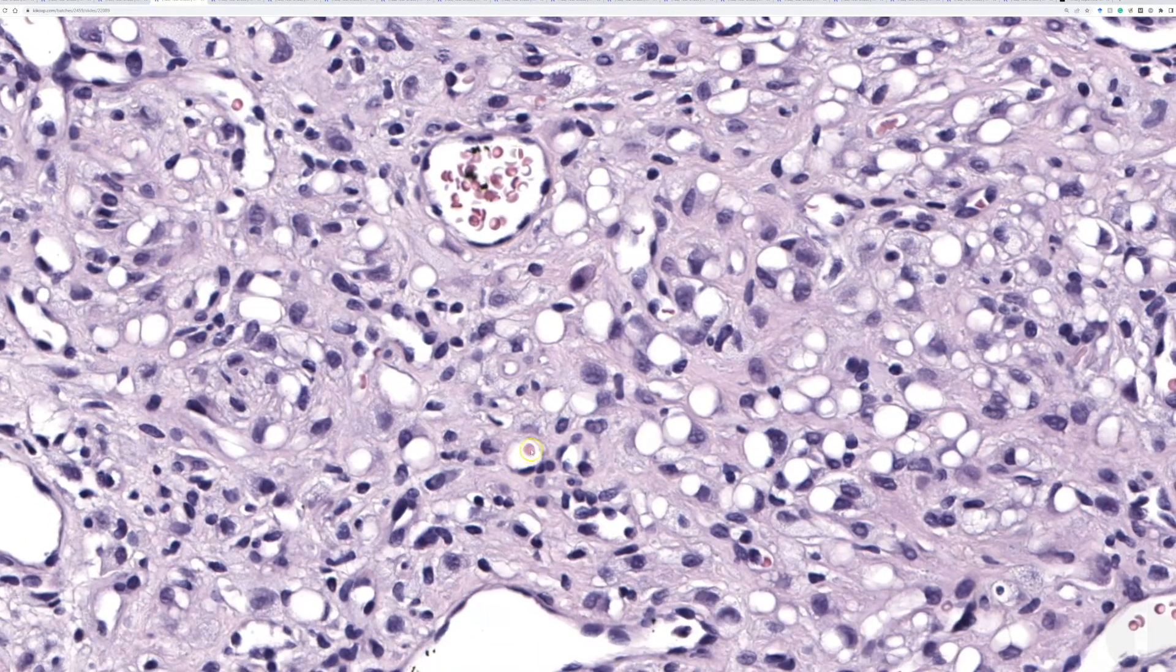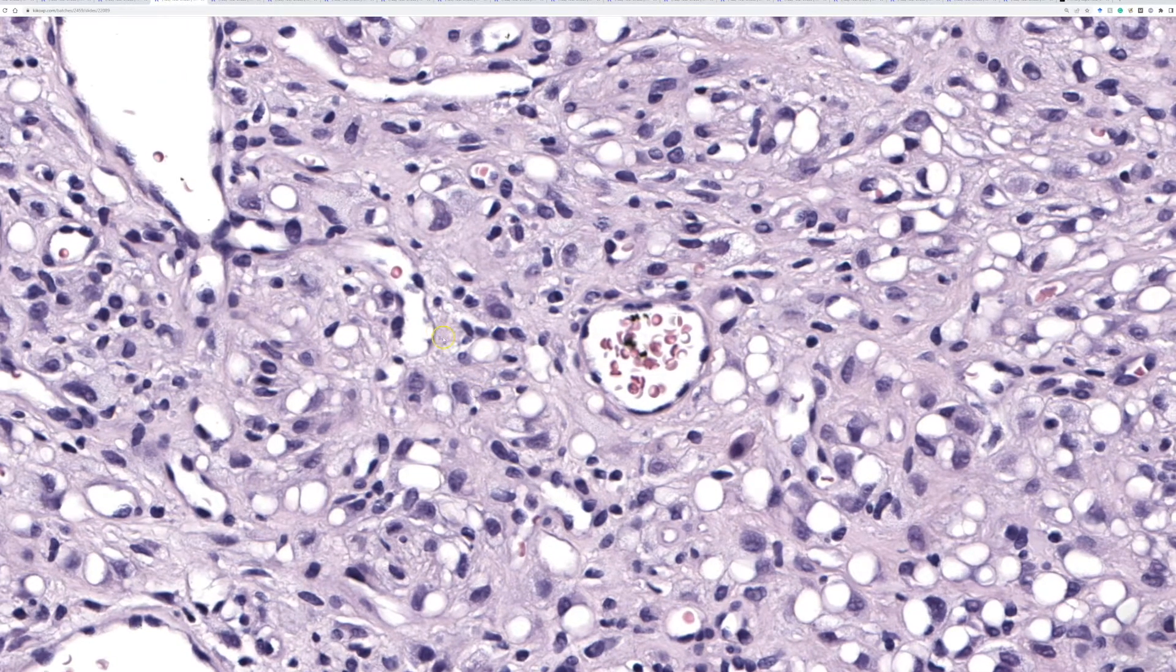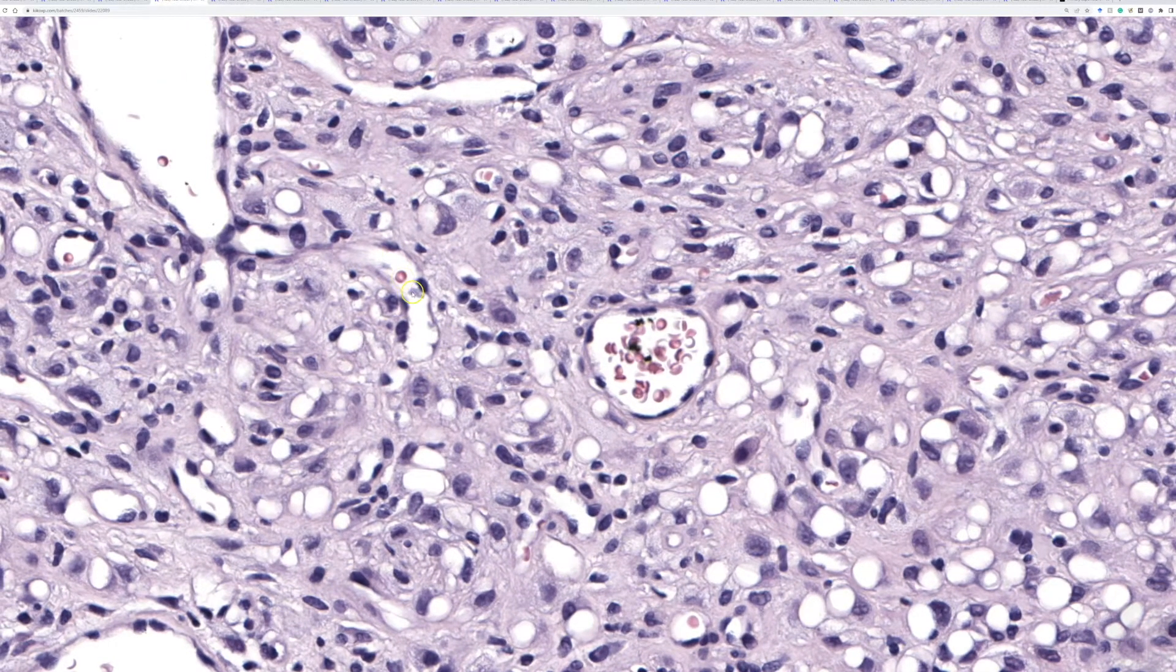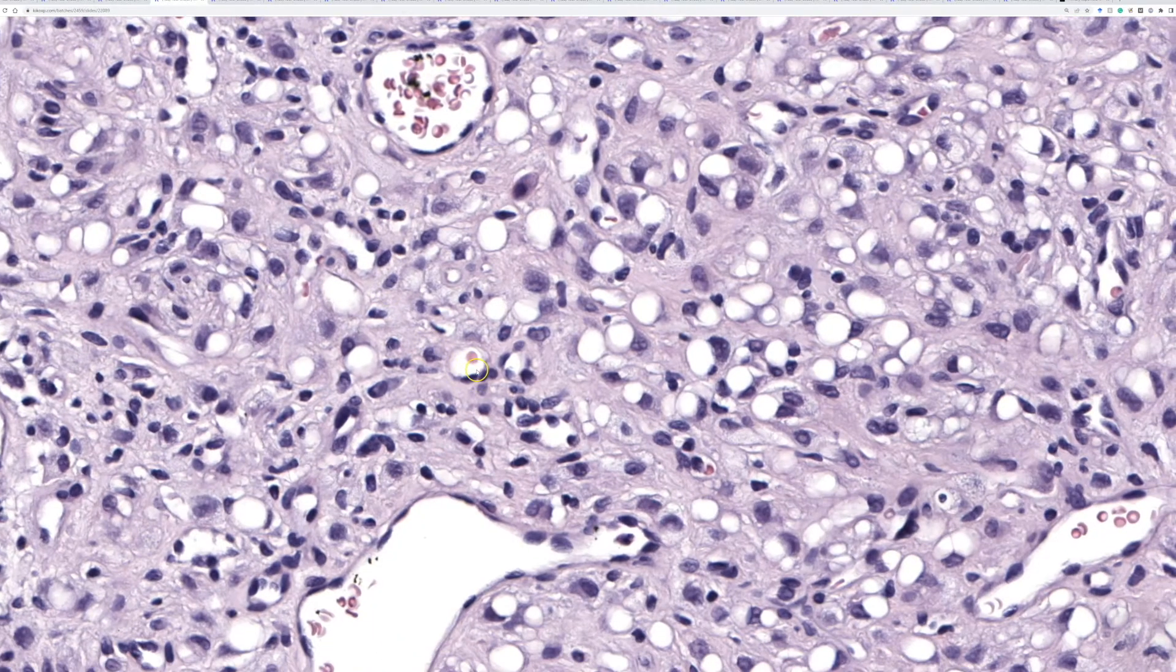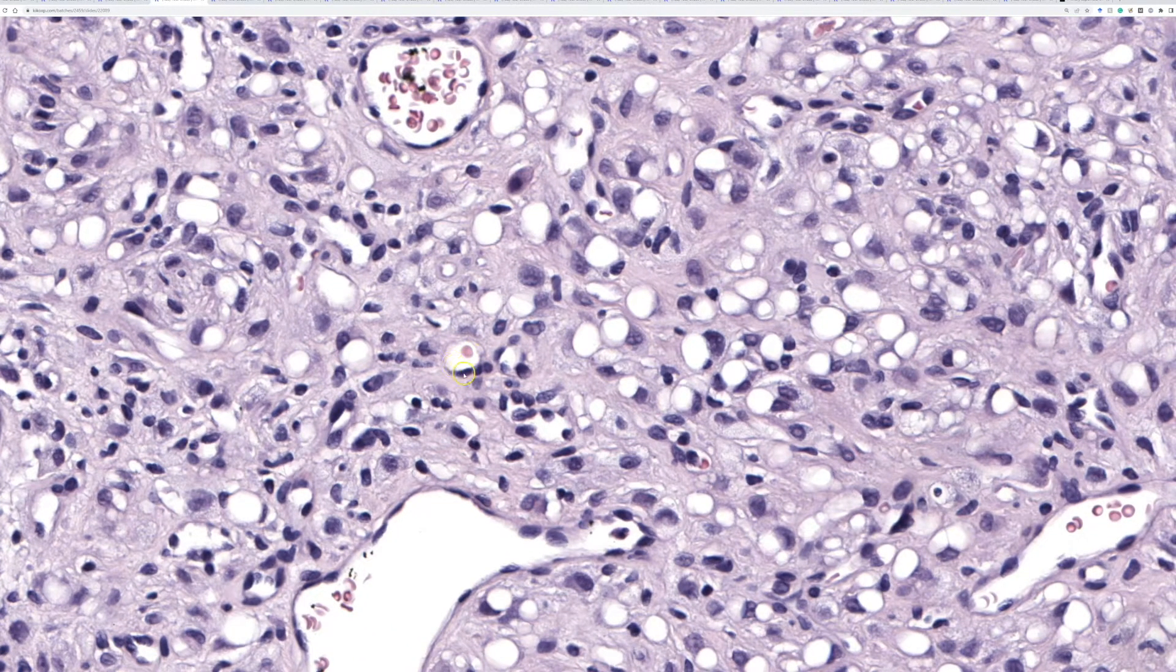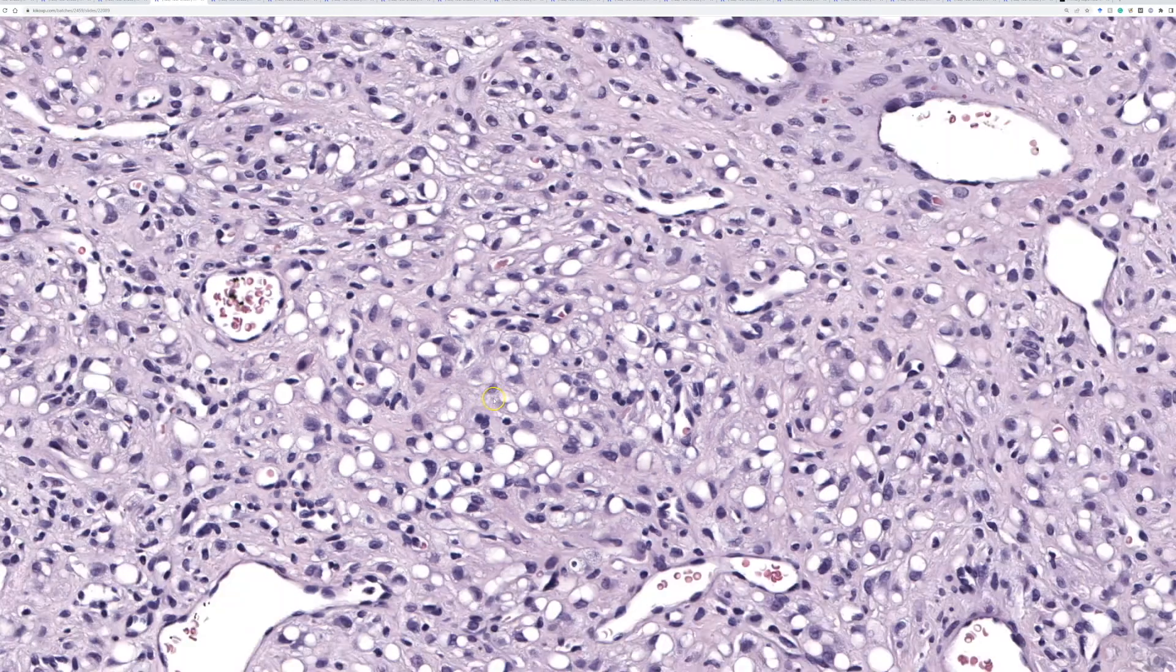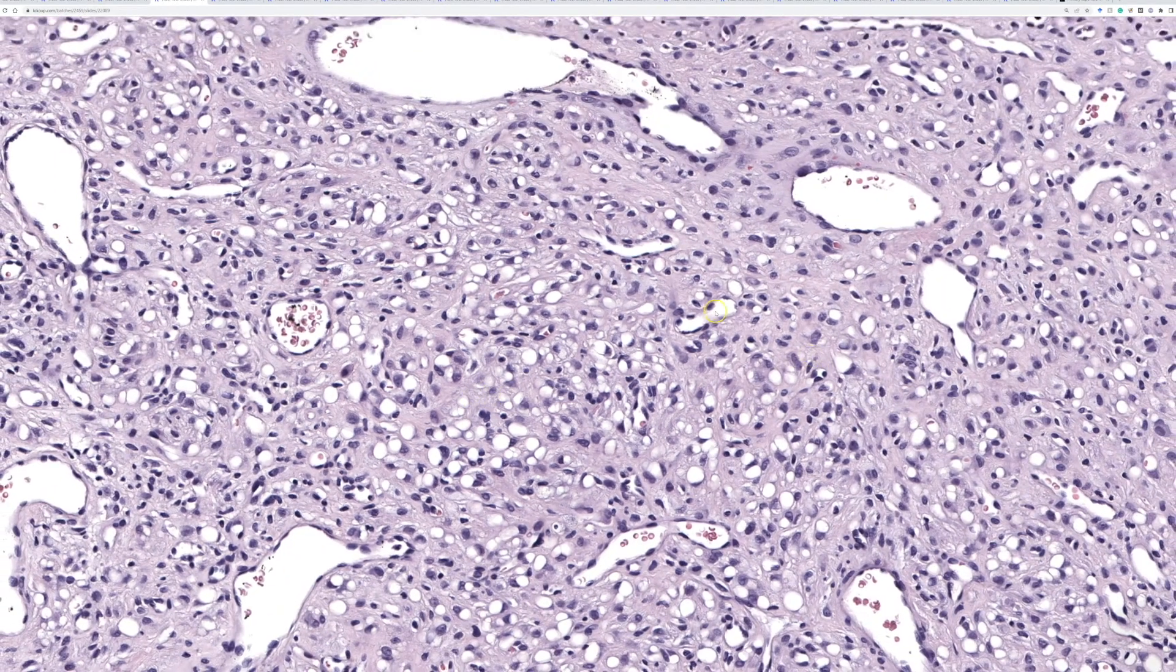Occasionally, you can see some little pink globules here. I think they are actually red cells, most of them in vascular spaces. But in some areas, you could wonder, is this a blister cell like you'd see in an epithelioid hemangioendothelioma? That could cross your mind potentially.